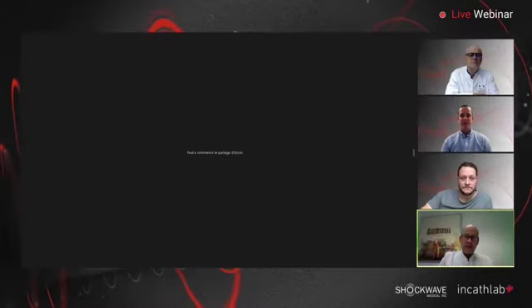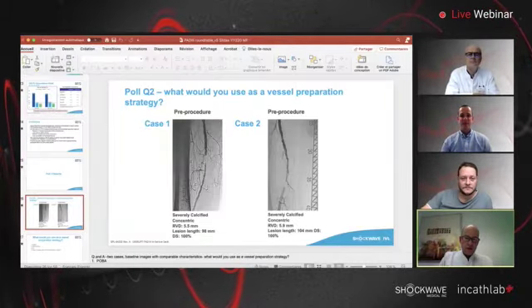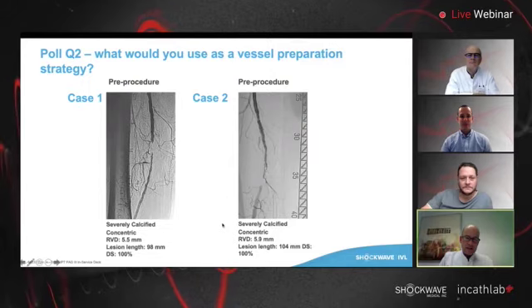So my next question is for Professor Tepe. Would you like to share some cases that you have, so at least we can comment on them after all this data? We have prepared 2 cases which were treated within that trial. These are SFA cases with a total occlusion, you see this here on the left-hand side. Two cases, not very long occlusions, but calcified occlusions.